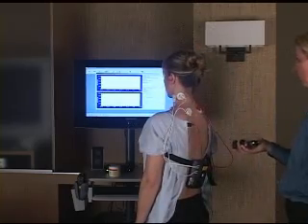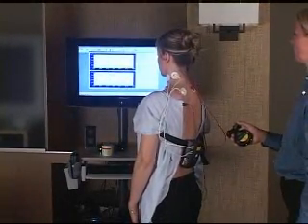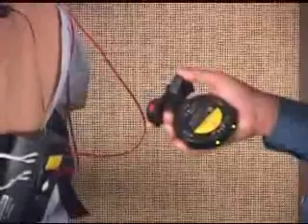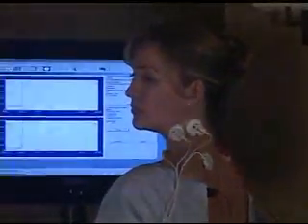Now we're going to do rotation. Because we cannot measure rotation with the actual device itself, we do it in a standing posture or seated. We use the button press on the FlexVision to take you through rotations. We're going to do 3 in a row.